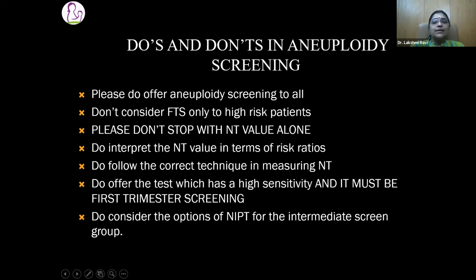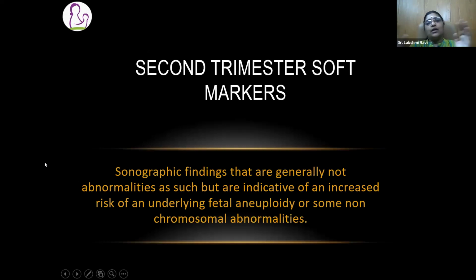Once you understand this, now I'll take you towards the second trimester soft markers. Now I have told you about the 11 to 14 week scan and how we handle aneuploidy screening at 11 to 14 weeks. Now, the second trimester soft markers. So what are soft markers?